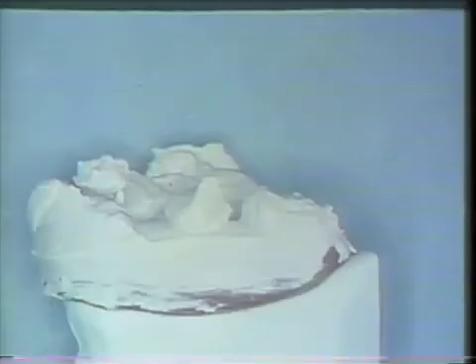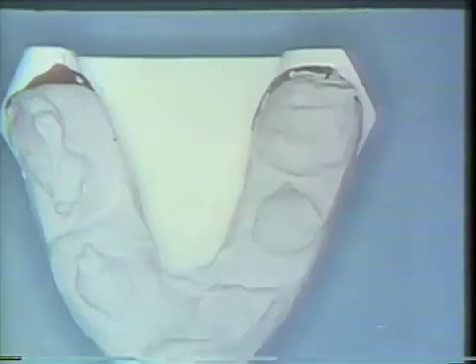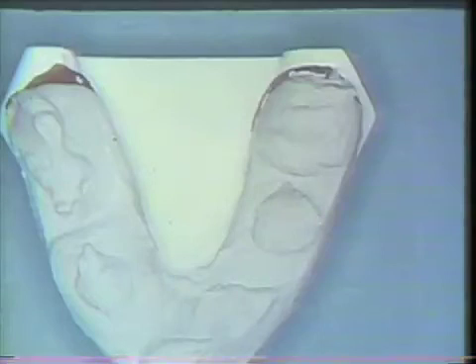Our first pour of stone is dry, and you can see we left some small nubbins of stone so that it will lock itself well into the subsequent amount of stone that we will put on to attach it to the articulator. And again, an occlusal view showing the small nubbins of stone and the first pour. We are now ready to attach this to the upper member of the articulator.